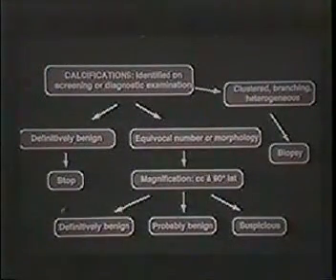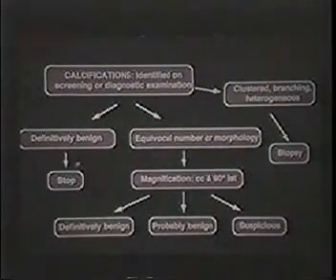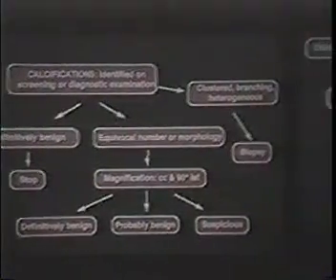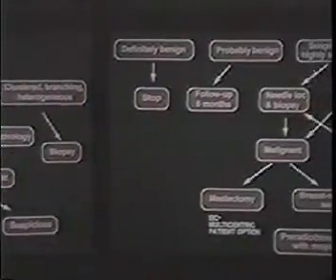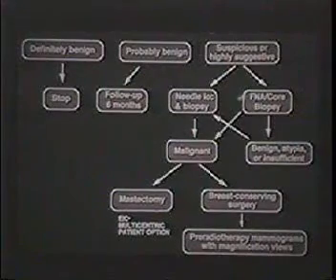If they are not that certain, then we can classify them as a result of the magnification views and our diagnostic acumen as definitely benign again, so that they don't need further workup. They may turn out to be probably benign, which means that the chance of being malignant is very low, and we wouldn't want to biopsy those cases because the yield would be too low, so they would go into a 6-month follow-up category. And those that are suspicious would go on to workup. We can see that laid out here. For those that are suspicious or highly suggestive, needle localization and biopsy, or core biopsy, or fine needle aspiration.